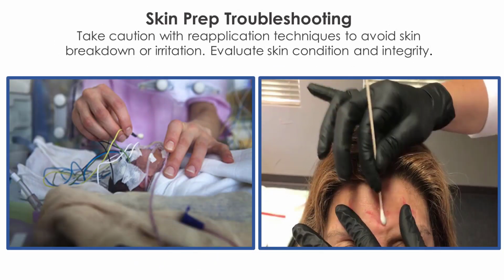The patient's skin preparation is crucial to low impedances for your study. If you determine that the skin needs to be reprepped, please make sure to take extra caution with repeated scrubbing to prevent any skin breakdown or injury. This is especially important for patients with sensitive skin, pediatric and neonatal patients, and also patients that may have other medical conditions that weaken their skin integrity.